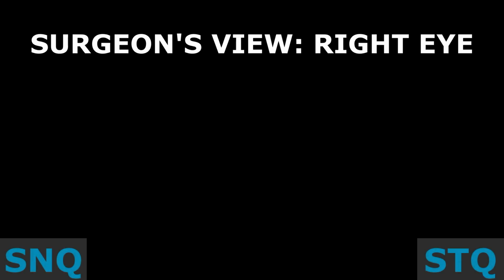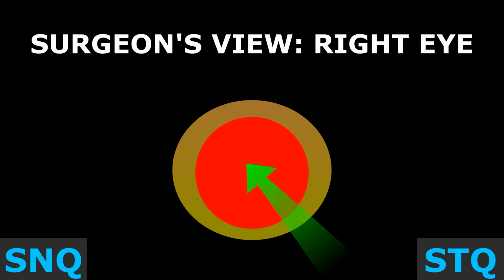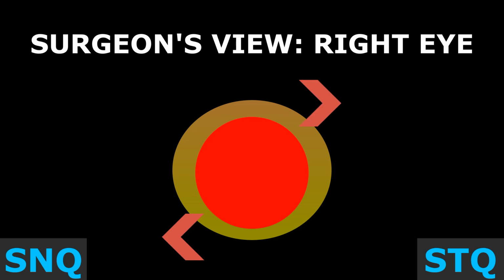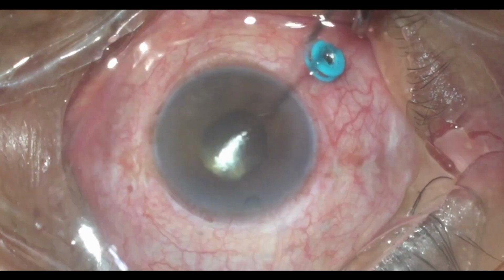Now, there were a few unseen challenges, as the 3 and 9 o'clock ocular surface was already scarred because of the previous buckle. Hence, I decided to enter via the superotemporal quadrant, remove the bag IOL complex and place a new SFIOL in a way that the haptics can be tucked at 1 and 7 o'clock. Yes, it was challenging and unconventional, but this was our best shot.